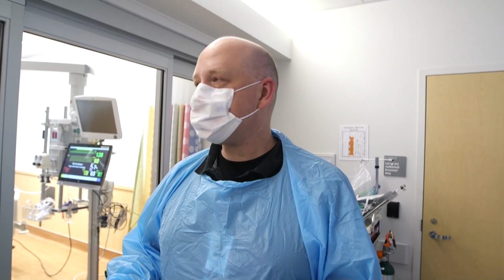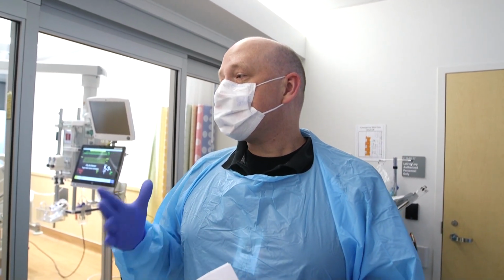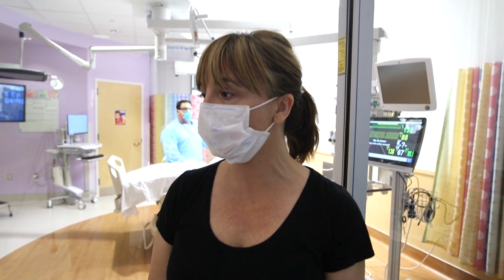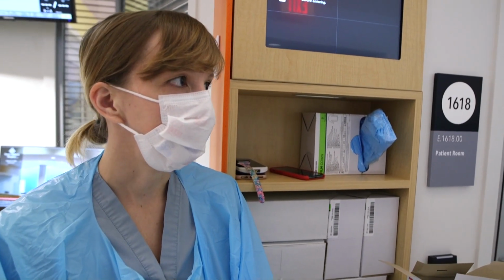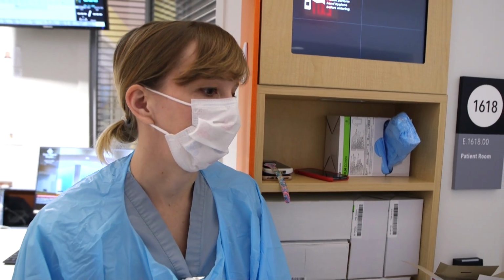Just before we go ahead and intubate, my name is Dr. Lemke. I'll be the team lead. I'm going to be gowned and gloved, ready to go in after I put on an N95 if you guys need me. I'm Dr. Bastero. I'm going to be the physician intubating the patient. I will be inside the room, and I will use the CMAC if possible with RSI intubation sequence, and I will be gowning just to go in as soon as we finish huddle. And I'm Cynthia, and I will be a PPE monitor, and I will also be ready and gowned up to go into the room if the patient decompensates. At that time, I will put on an N95 and goggles.